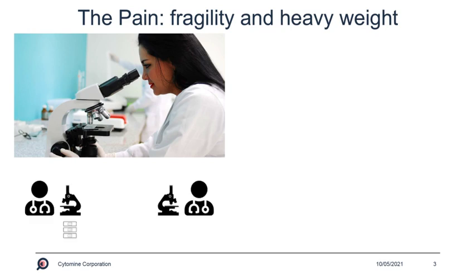The sample is placed on a thin slide of glass that is very fragile, so when the pathologist needs a second opinion from a colleague, he will definitely avoid making this slide travel. The risk of having it broken is too high.